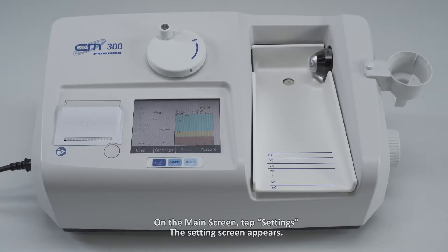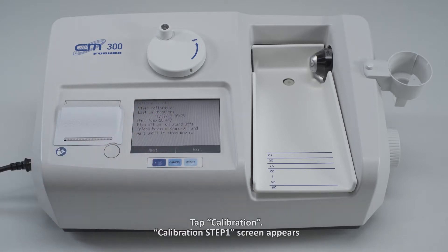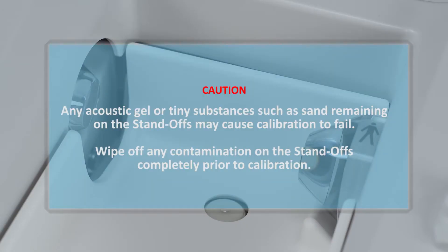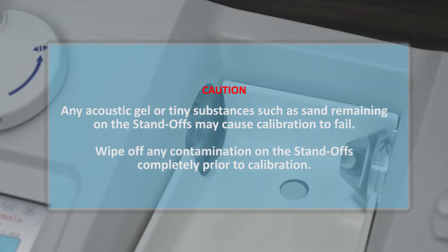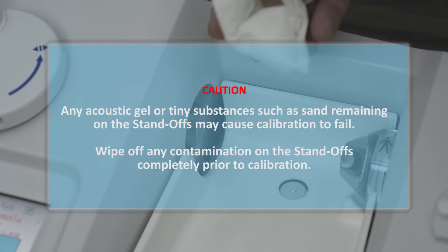How to do internal calibration on the CM300. On the main screen, tap Settings. The Settings screen appears. Tap Calibration. Calibration Step 1 screen appears. Any acoustic gel or tiny substances such as sand remaining on the standoffs may cause calibration to fail.